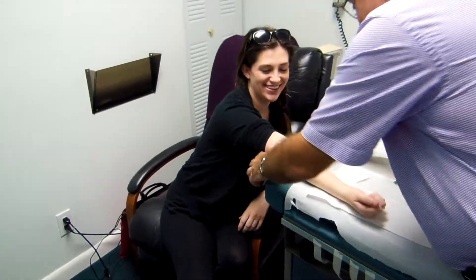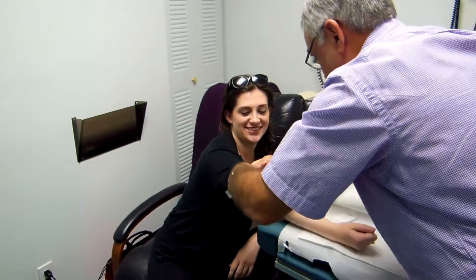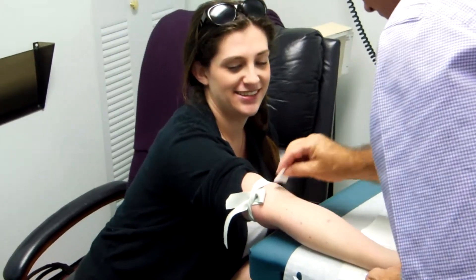Good morning. I'm going to start your IV here for your IV saline. Thank you. We do this quite regularly and we've got it pretty much down to a science.